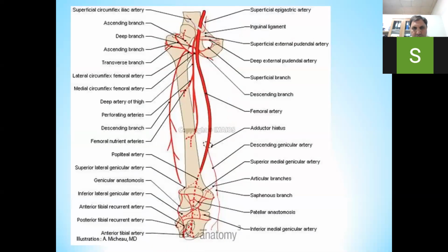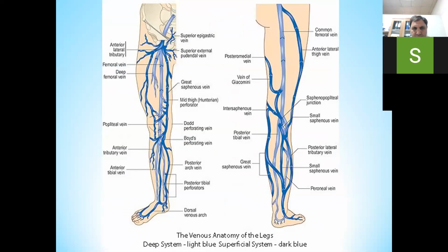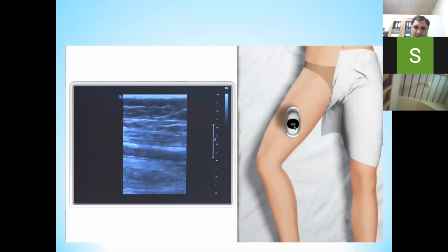And here we'll discuss sonographic examination techniques. The sonographic examination of the lower limb is started from the inguinal crease while exposing the entire leg in a private room, giving priority to the privacy of the patient.